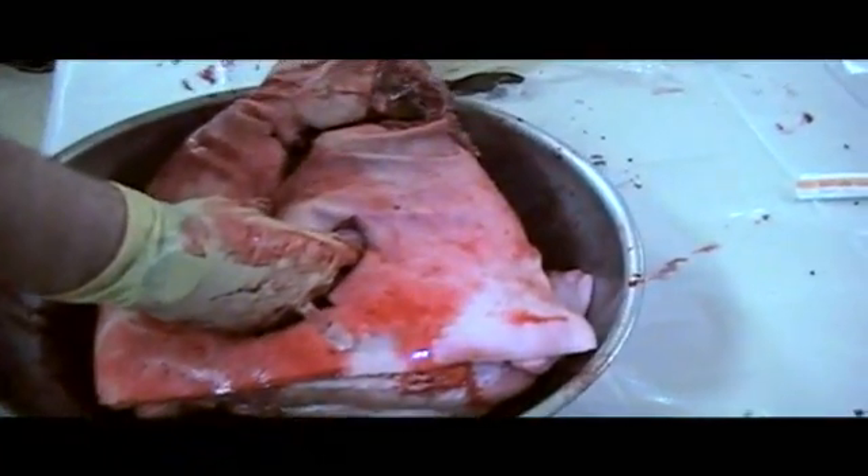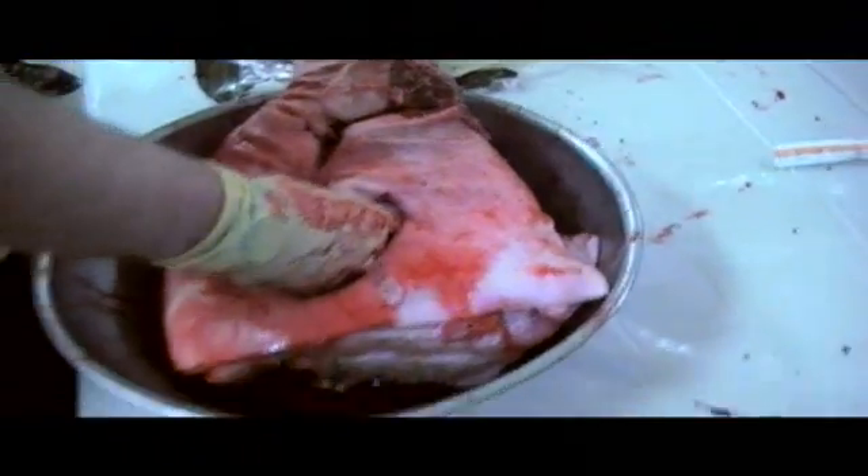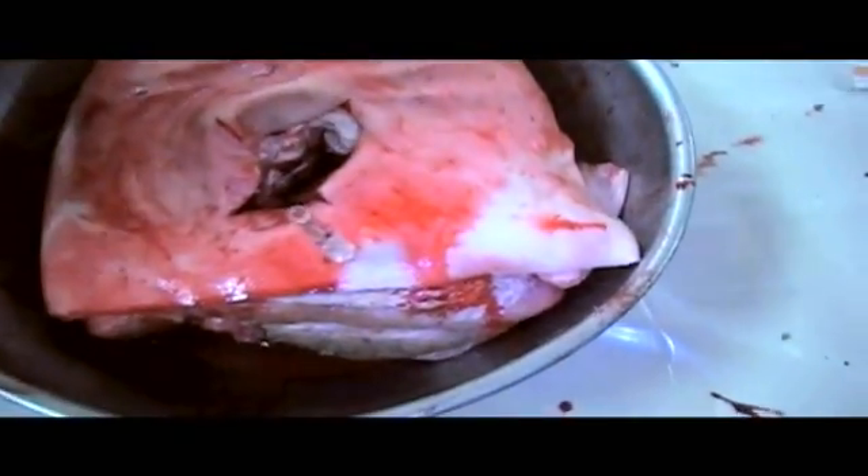This was the Selox — the regular impregnated Selox gauze. Again, copious amounts of direct pressure using a C-clamp in the wound cavity.